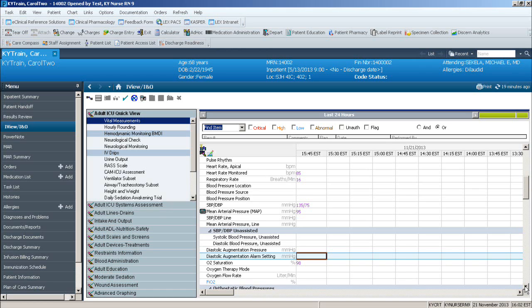The value that was pulled into the patient's chart was 82%, and as the patient's nurse, you know that the patient's oxygen saturation has been in the upper 90s. In this case, you would go into the patient's room, ask the patient to keep their finger still for a moment, and see what the proper oxygen saturation measurement is. You would then clear the 82% from the patient's chart and input the correct measurement. Then you would sign the patient's chart and the text would turn to black.